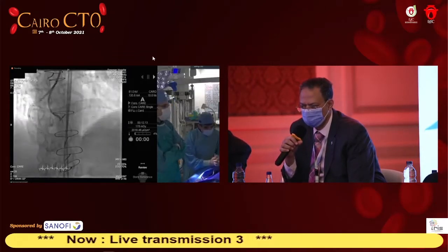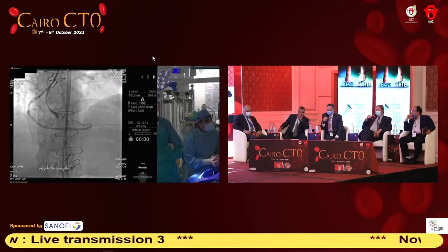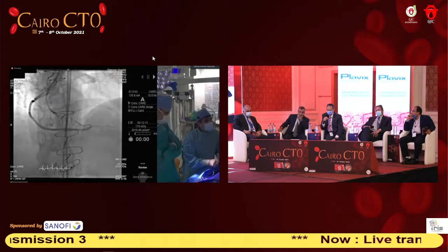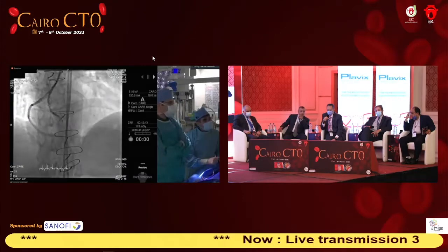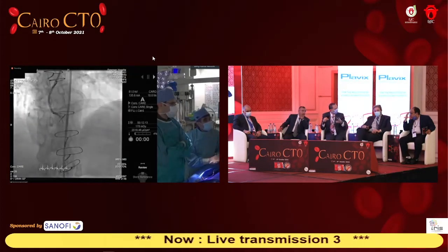I don't know, Mohanad. What do you think about medical treatment in this case? What's the harm of medical treatment here? Well, I mean, there's no harm, clearly, but as I said, the lady presented with 2 MIs now. We know that this vein graft is degenerating, and I think you could see that the stents are underexpanded, and to my mind, very undersized.